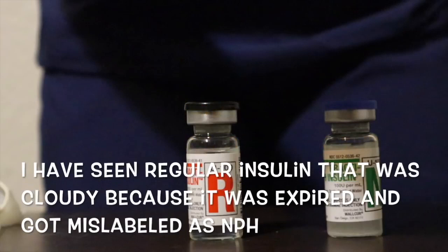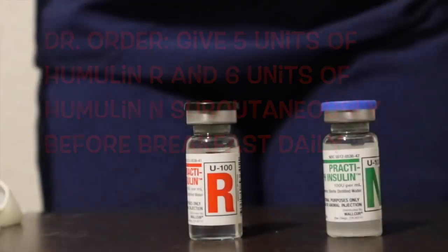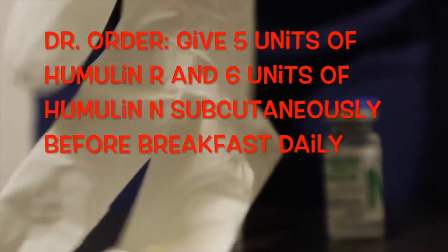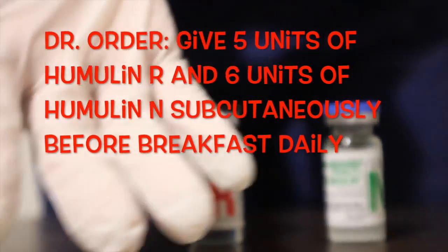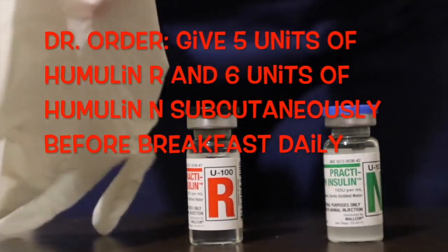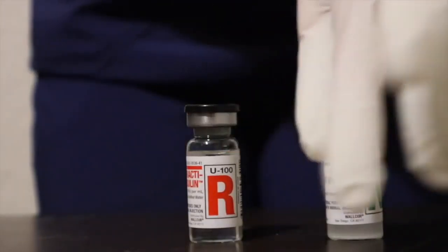I have seen regular insulin that was cloudy because it was expired, and if the medication label wasn't checked, it could have been assumed that it was NPH. So make sure you do your medication rights. Confirm that you have a doctor's order to give this medication. For the purpose of this video, we will use the doctor's order posted in the caption: give five units of humulin R and six units of humulin N subcutaneously before breakfast daily. Because it's a clean technique, not sterile, I am going to put on regular gloves.